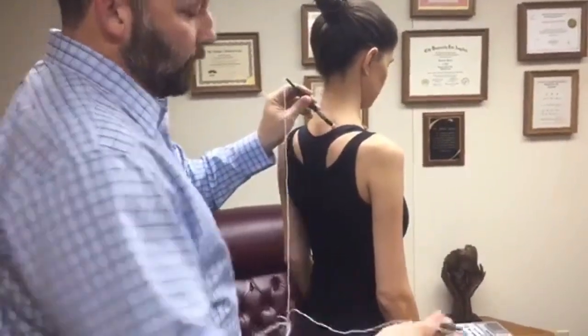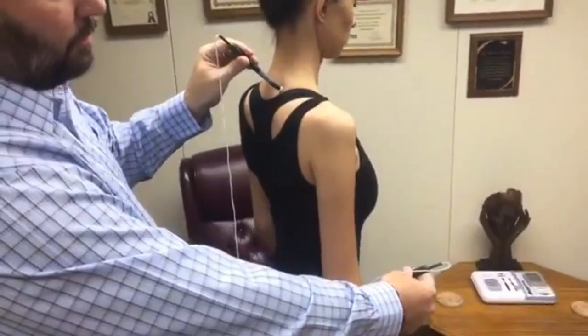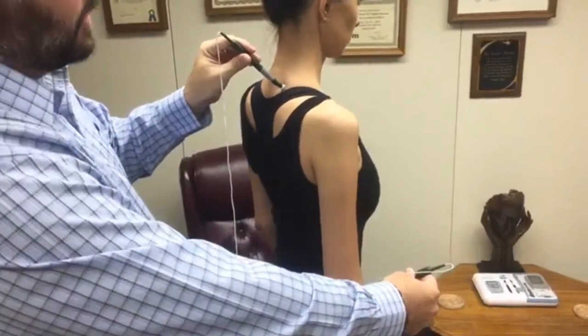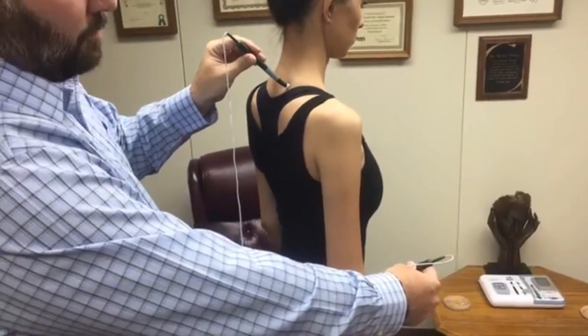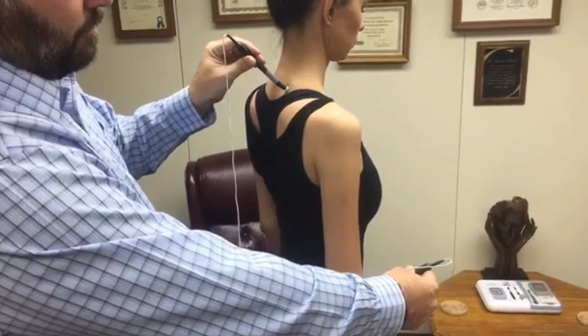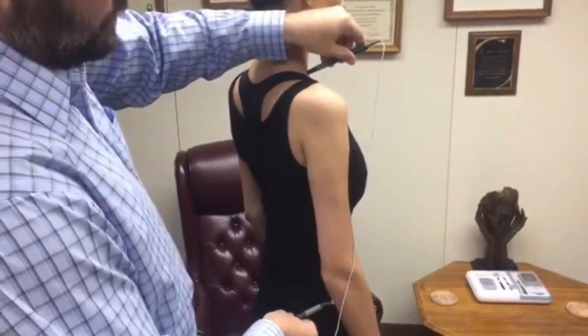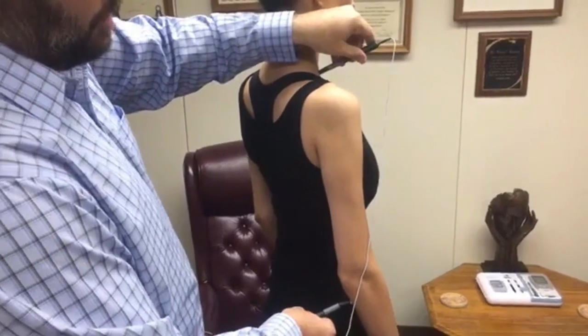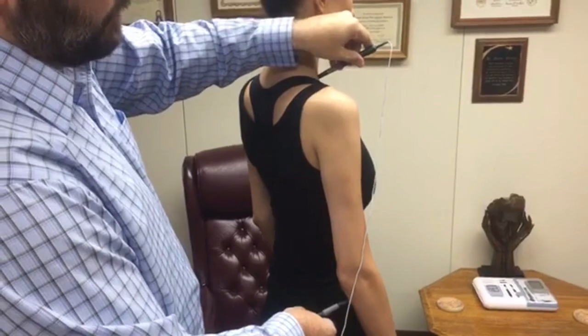The first step of our protocol is a large X — we just go posterior to anterior. You heard it beep, so we'll watch it count down for 10 seconds, then it'll beep again when we finish. To complete our X, we go anterior and posterior on the arm. This is a big X encompassing the forearm, up to the neck and shoulder — so we're covering everything.